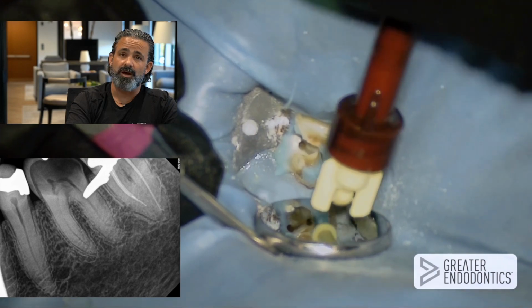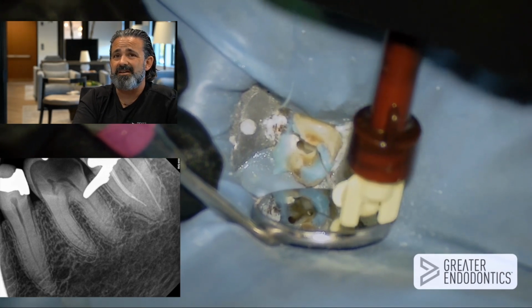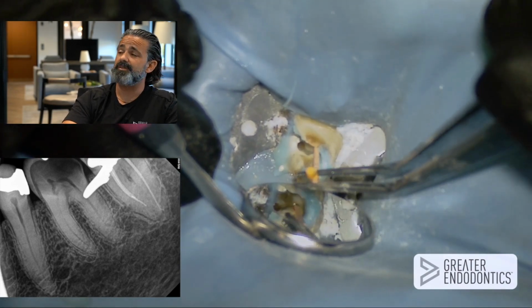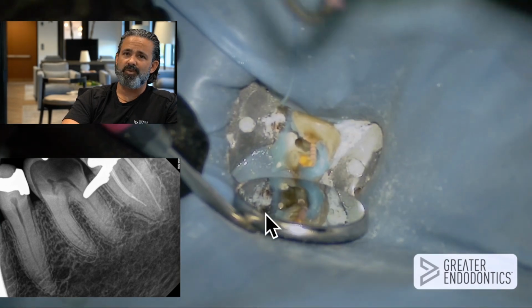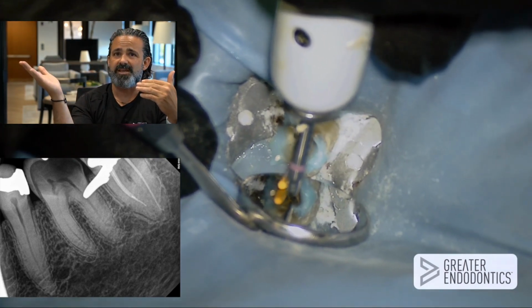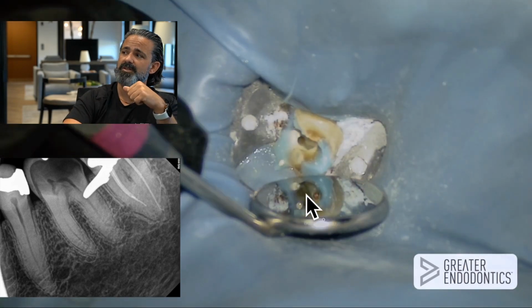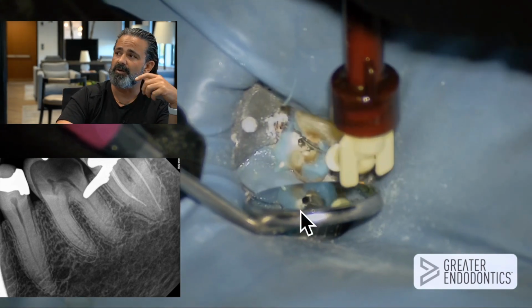And now I'm going to obturate. This is really standard for me, to obturate a canal at a time. I didn't used to do that. You can see how injected here, the sealer came up here. I saw that before, but I see it all the time with GentleWave. Place the master cone, and whatever comes up this side, what if it's fluid? What if in that isthmus space, it's just the water, or in this case, since I placed bleach in again, bleach. I don't want a salt bleach crystal to form in there. So what I'll do is pack the one side and then wick out that other side with a paper point. And that's something that I like to do, although I jumped to the distal right now.